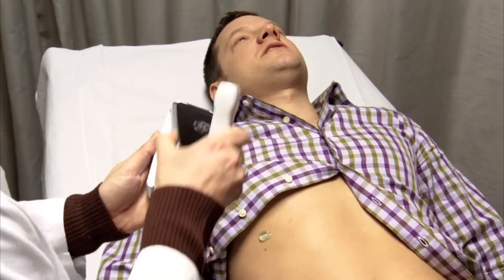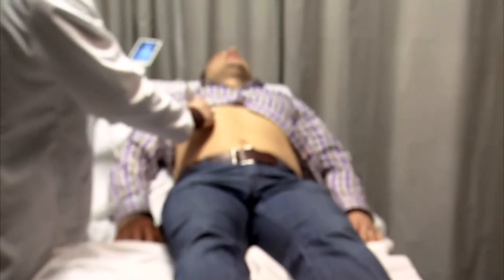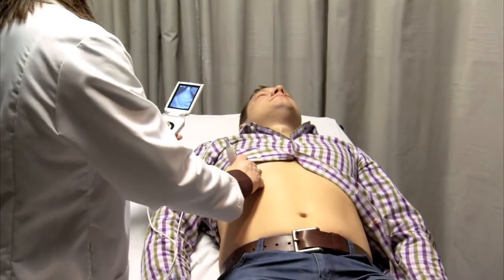V-scan will change the way that doctors look at patients. You can see what is really going on and that will make him much more confident in his diagnosis.